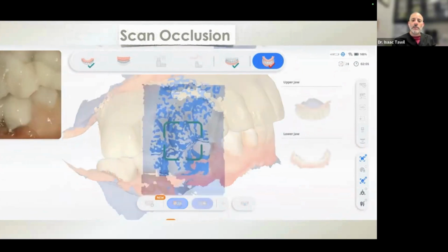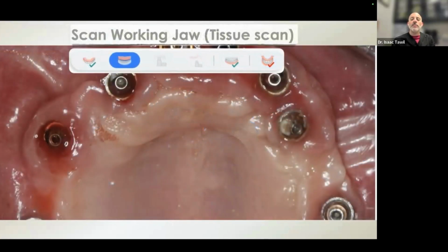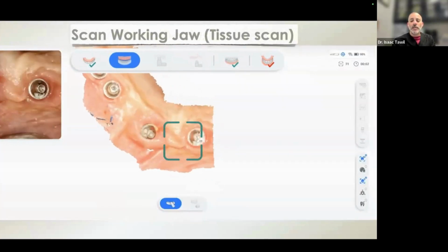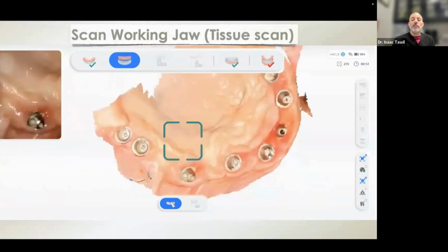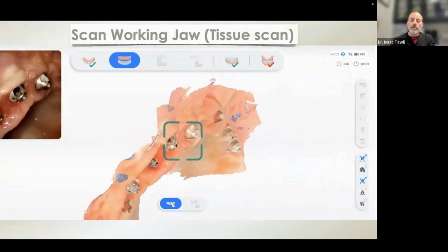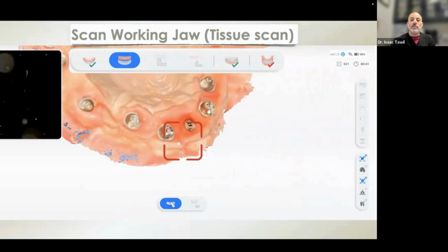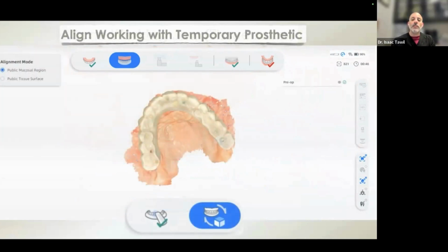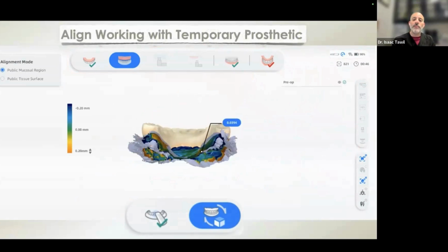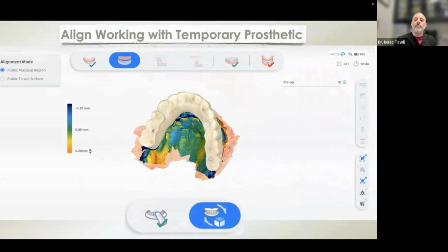Works very fast. Now we can remove the prosthesis from the mouth, and we can start to scan just the multi-unit position. I do not want any scan bodies. I do want some soft tissue so I can align my pre-op with the provisional to my current removal of the prosthesis. So those two will align nicely. You'll see here, once I hit play, it will now give you a heat map showing the layering of the two. So we're very, very nicely matched with our provisional and our multi-unit scan.